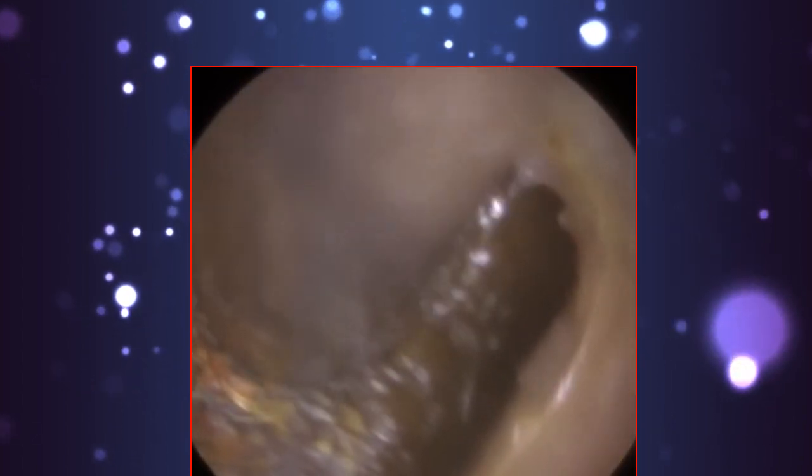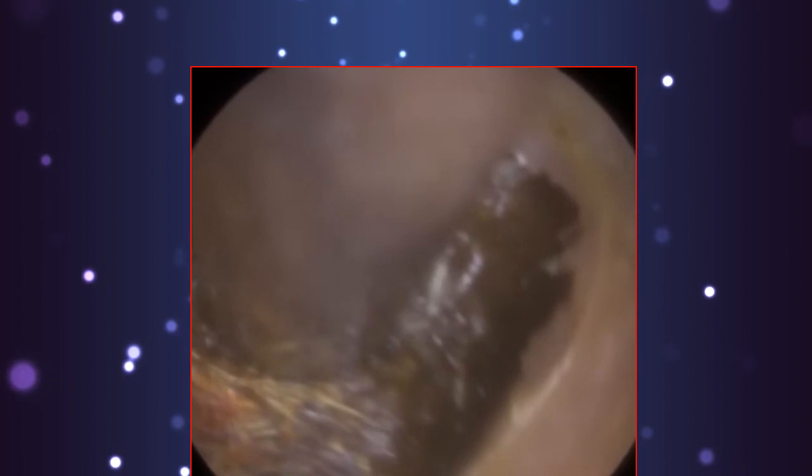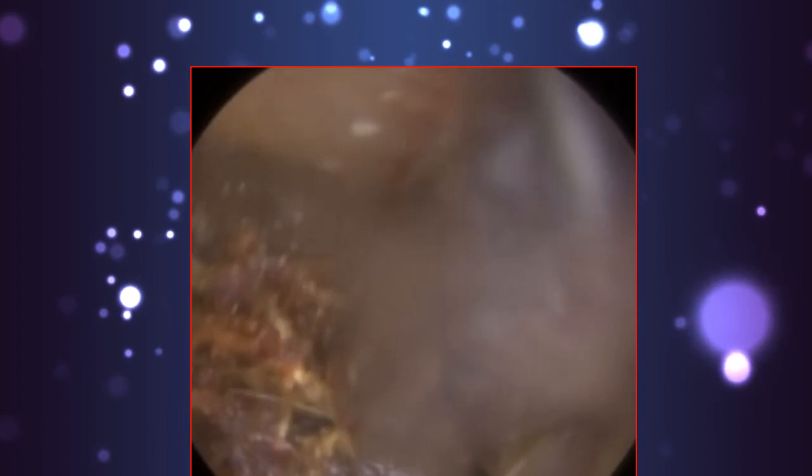I'm really just trying to bring this down. I think you can tell just by watching the video how much force I'm putting in to bring this out of that top ridge where it narrows. Yeah, I've just put some more drops in.